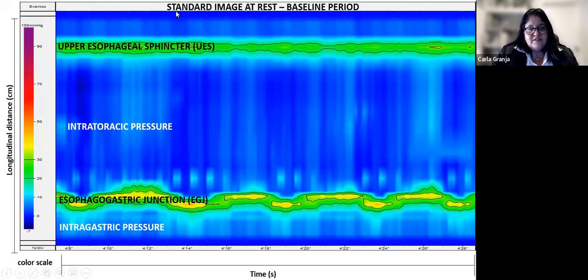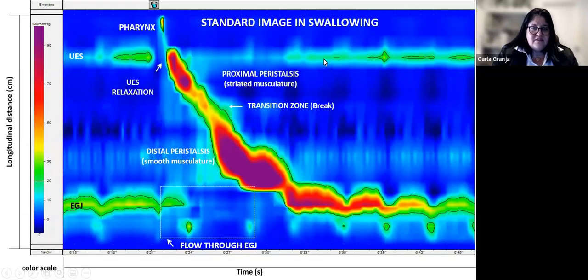Here we can see the standard image at rest with the baseline period. In the proximal part of the graphic, we see the pressure impression of the upper esophageal sphincter. And in the distal part, we can see the pressure impression of the esophagogastric junction that respects the oscillation of the respiratory sequence.